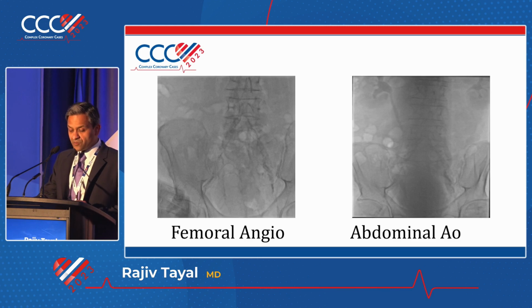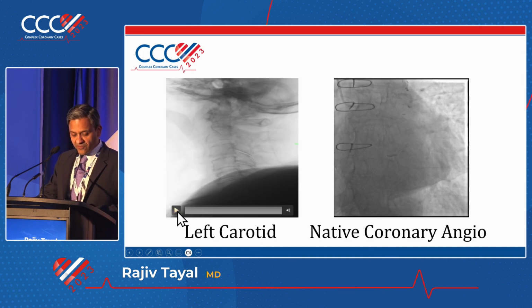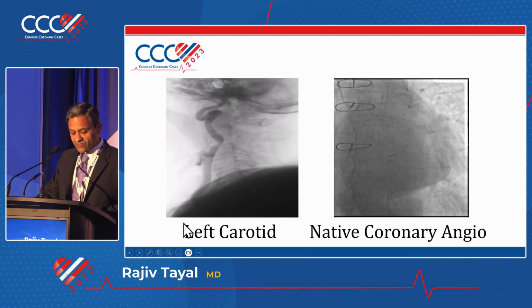The team I was asked to proctor was actually a team in another state that had very little case experience. They had a total of 25 cases. The patient didn't want to go to another institution. We had reviewed this film and kind of looked at it. And there you can see the femoral angiogram, and you can also see the abdominal angiogram, so it is very consistent with Leriche syndrome. We evaluated him both by CT as well as angiography to look for possible alternative access sites for his transcatheter valve replacement because he had severe AS.